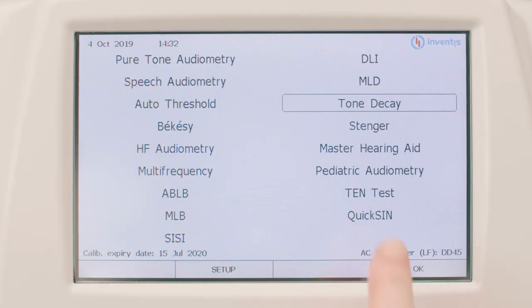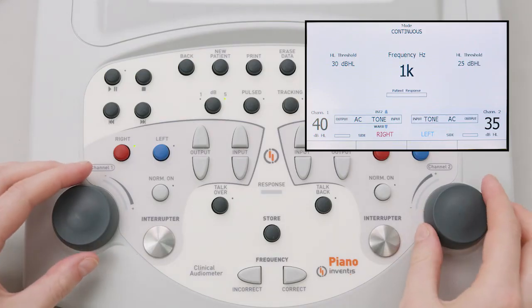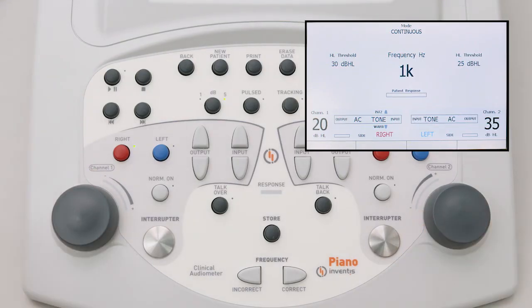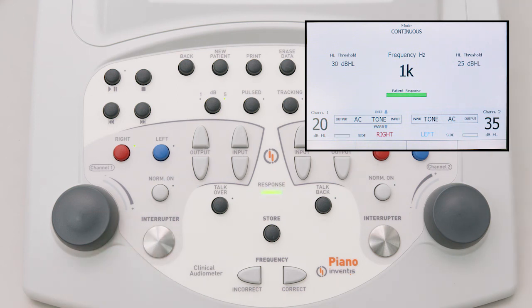To perform the Stenger test, the operator must first bring up the relative window from the main menu. Having established the hearing threshold for a given frequency, the tone is presented to the good ear 5 to 10 decibels higher than the hearing threshold, and presented to the bad ear at a level slightly lower than the supposed threshold. If there is a genuine loss of hearing in the bad ear, the patient will indicate that the sound can be heard in the good ear. A different response means that the hearing loss is not genuine.